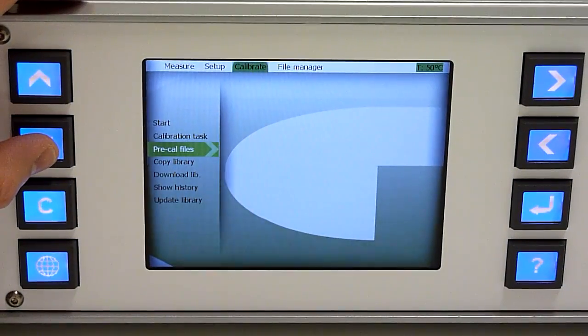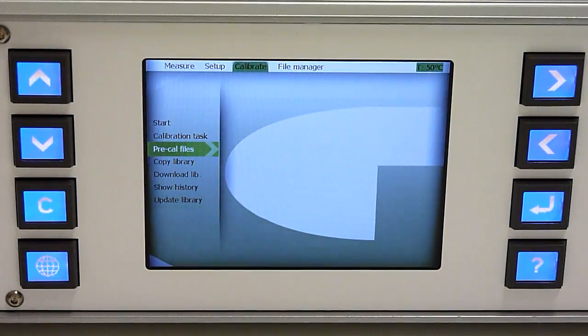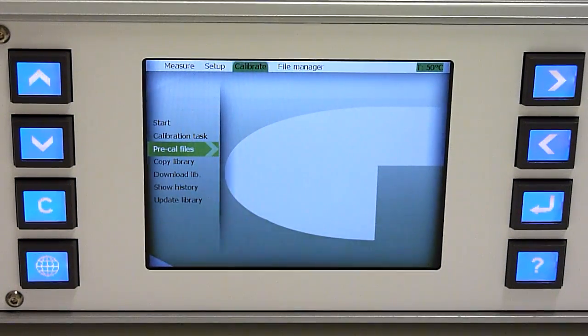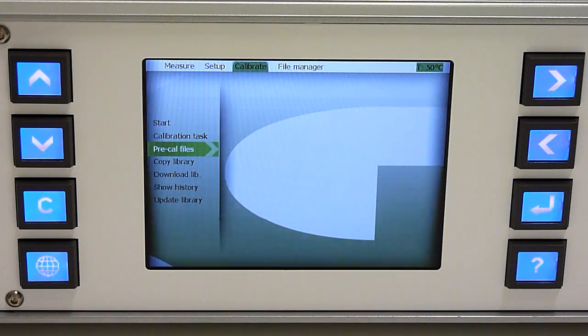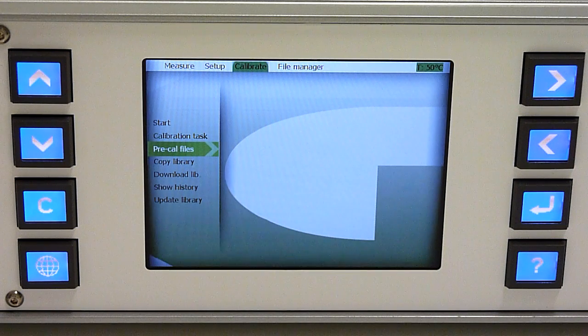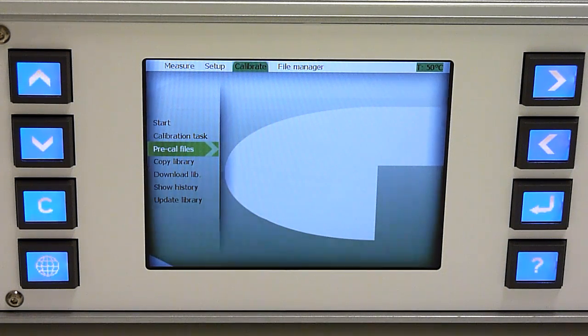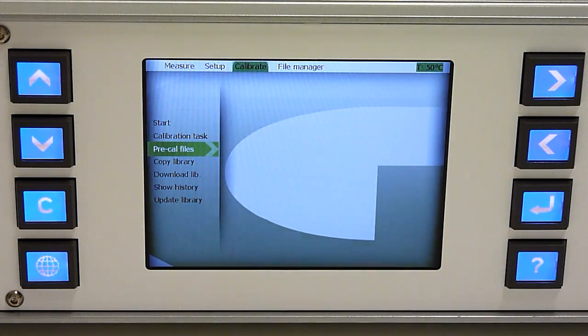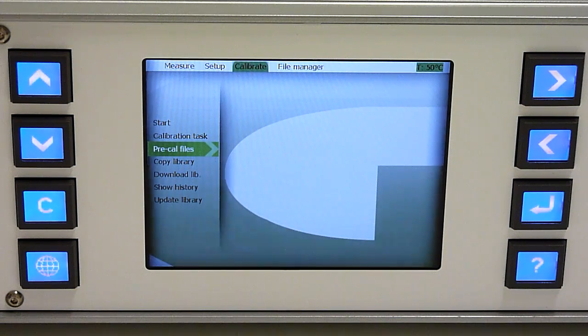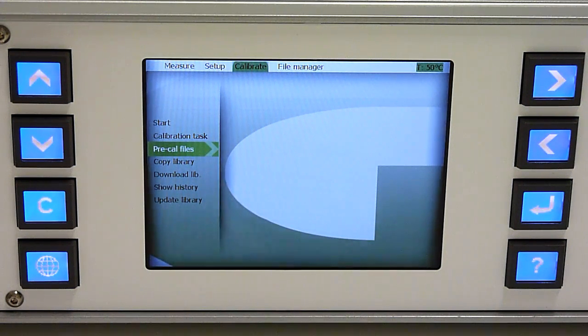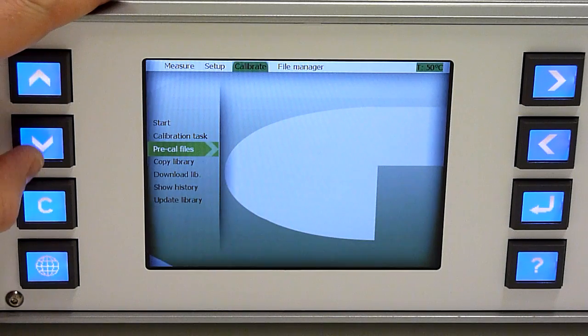Pre-calibration files are files that enhance the instrument dynamic range during the measurement. Those are factory installed and will be provided by Gasera for new gases.